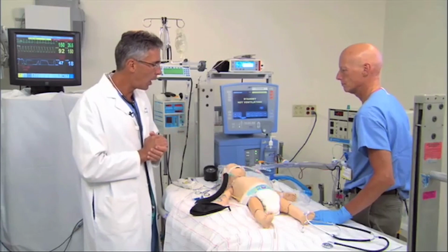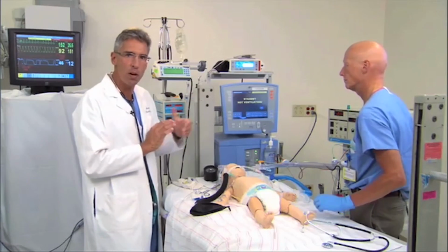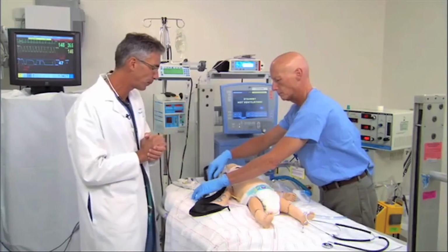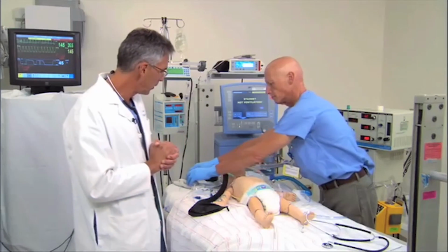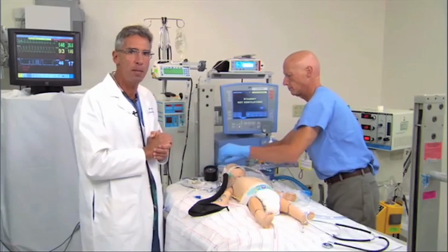So let's send another blood gas, Barry. I think it always helps to prove, in fact, that the lung is open. We're going to send another blood gas, perhaps even before the first blood gas returns, so that we'll have data in an ongoing way. And again, if I can remind you, keep in mind this wonderful picture of the open lung. A lot of pressure to open, but once opened fully, you can aggressively decrease mean airway pressure and maintain an open lung.